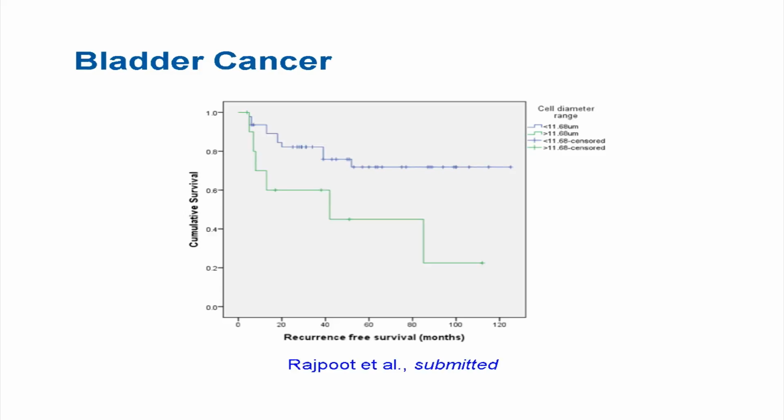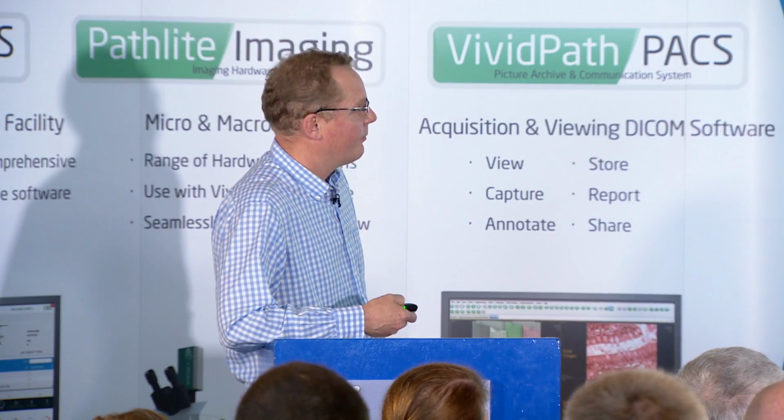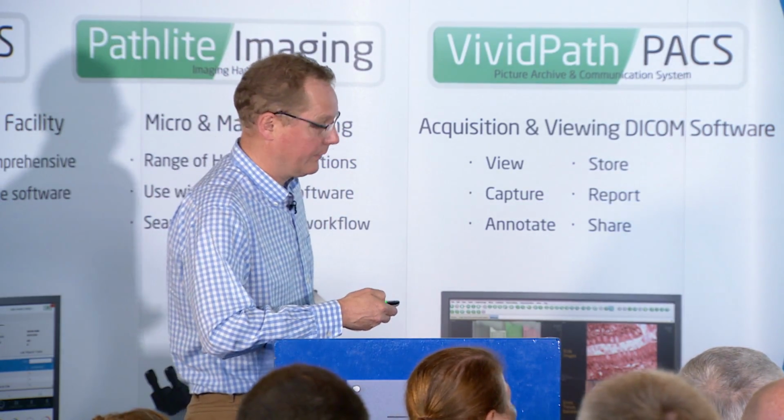And this is quite a nice study we did last year by two medical students doing their clinical attachment with us. And they took a load of bladder cancers, transitional cell carcinomas of the bladder, and they looked at mitotic index and they looked at nuclear diameter. And they got a very good split between correlating with disease progression and non-progression based on the cell diameter of the cells that they measured.